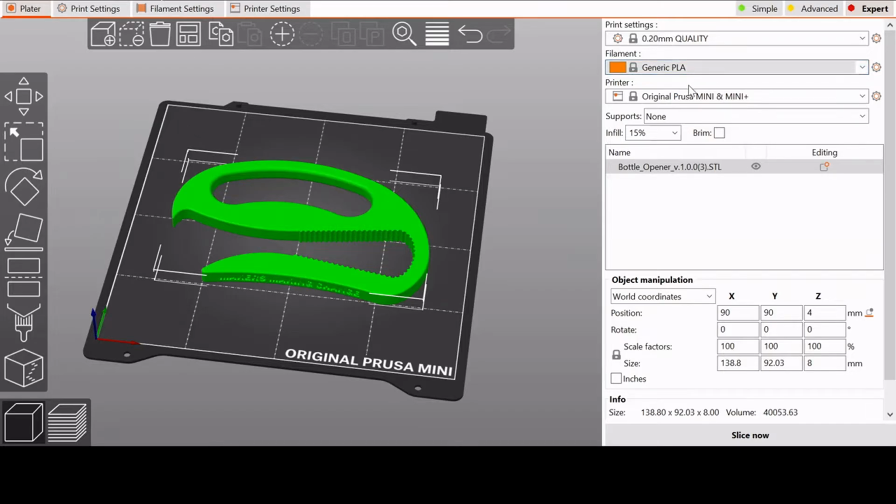Instead, I'll be using PLA, so I'll configure my Prusa slicer here to go ahead and print in PLA, because that's what I happen to have. Let's see, they recommend 50% infill, so I'll go ahead and do that as well, and we shouldn't need a raft or supports for this design as there are no overhangs.